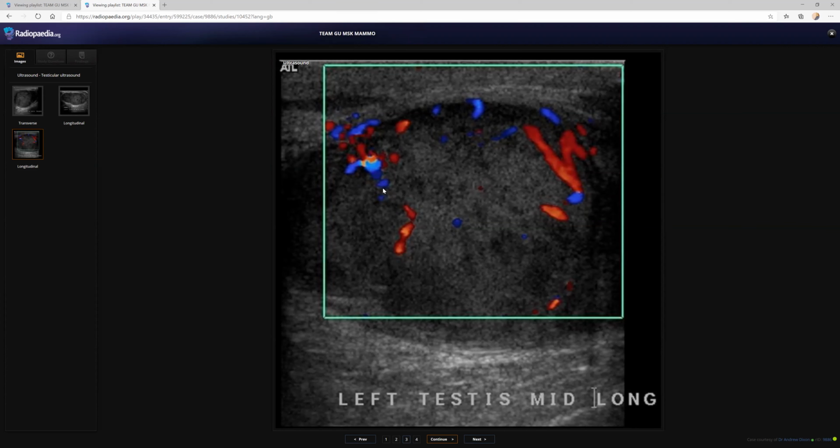And so in keeping with all these findings and including the summary, my first differential diagnosis is testicular carcinoma with retroperitoneal lymph node adenopathy. Another differential could be lymphoma.